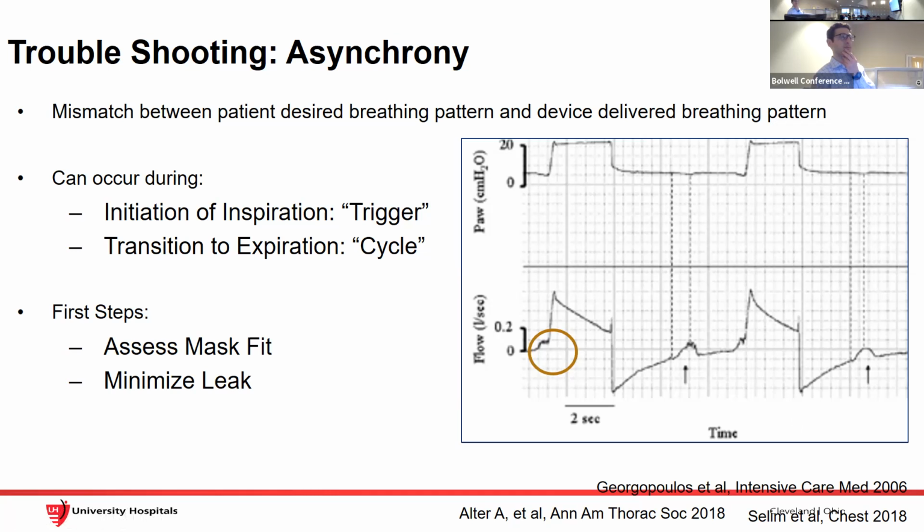The push is okay. So that's a great point. And then it stops, and the balloon goes around the room. Right. So then you tell the machine, when it hits 25% of the peak flow, then go to EPAP. And that's what happens. It drops to 0 flow, and then expiratory. The patient exhales, and the machine notices that, and the patient starts to exhale until about 0 flow. So any questions about that?